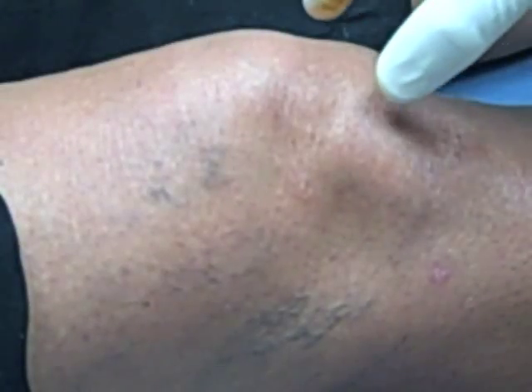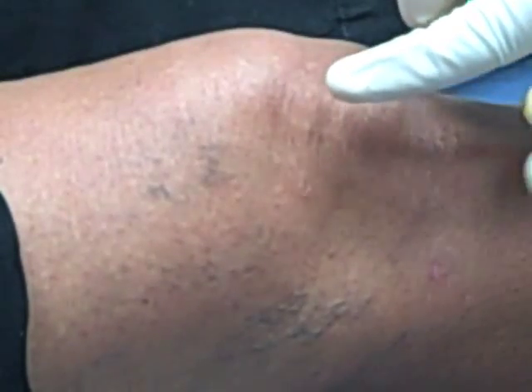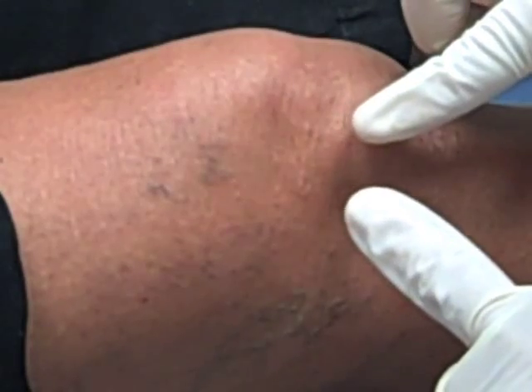Today we're going to be demonstrating a superior lateral approach with the patient in a supine position and the knee extended. We will identify the important landmarks for the procedure — for this approach the main landmark is going to be the superior and lateral aspects of the patella. The injection site is approximately one centimeter down from the superior and lateral edge of the patella.